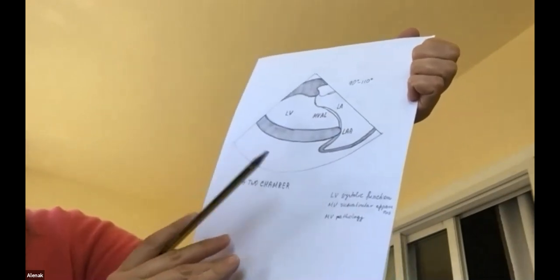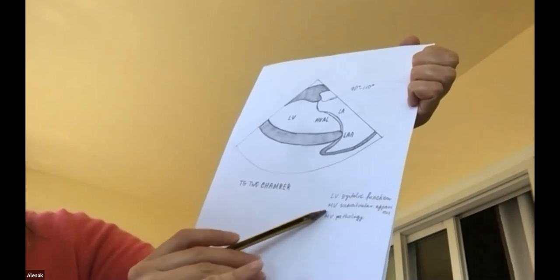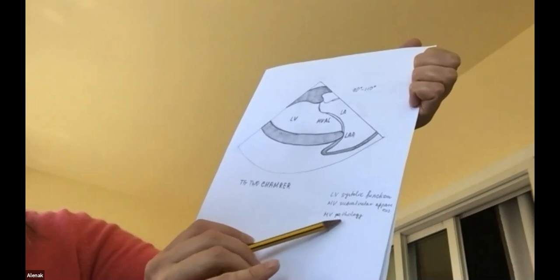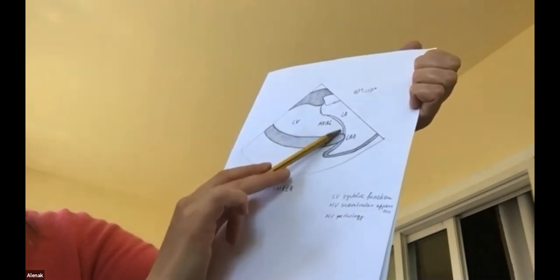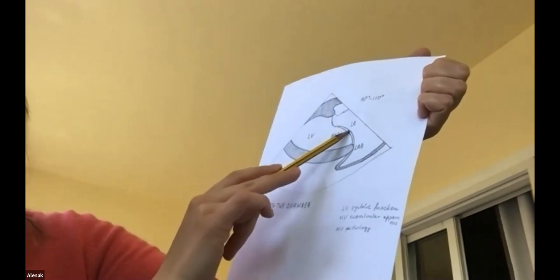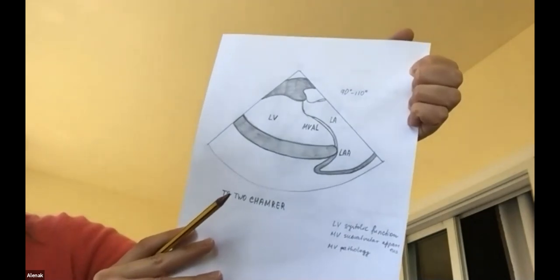This view is very good for left ventricular systolic function assessment, mitral valve subvalvular apparatus assessment, and mitral valve pathology, because it gives such a good portion of the mitral valve on this view.